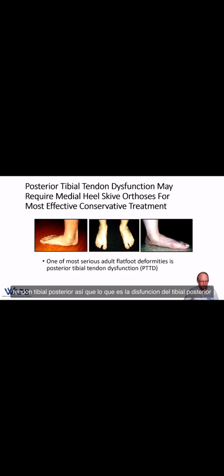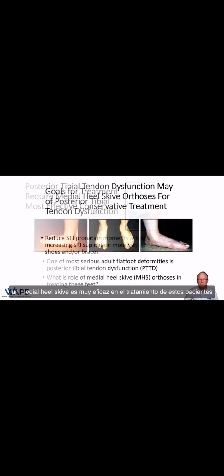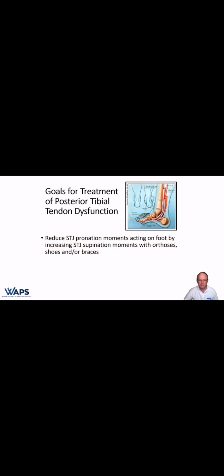So what is posterior tibial tendon dysfunction? Posterior tibial tendon dysfunction is one of the most serious adult flat foot deformities seen. The medial heel skive orthosis is very effective at treating these patients.